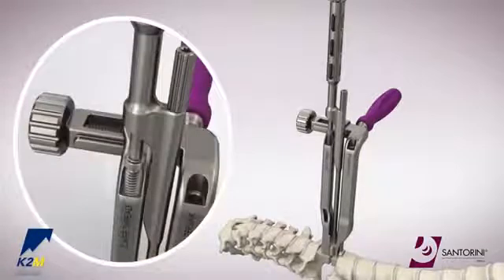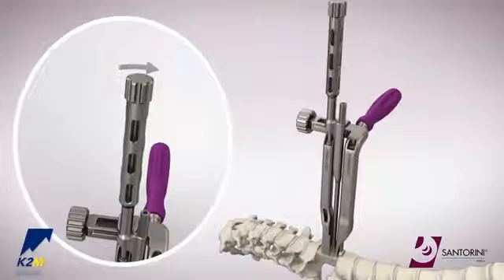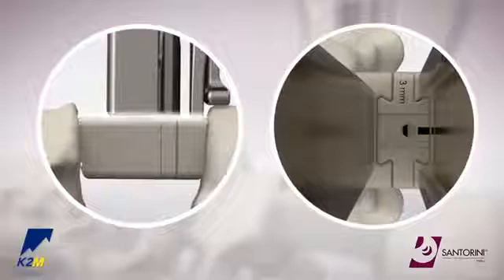Lower the clip inserter until the thread engages the proximal end of the distractor arm. Proceed to turn the proximal knob of the clip inserter clockwise to thread the clip into the cage. There will be tactile feedback as the clip seats into the cage. The clip will be fully inserted when it is flush with the cage body.